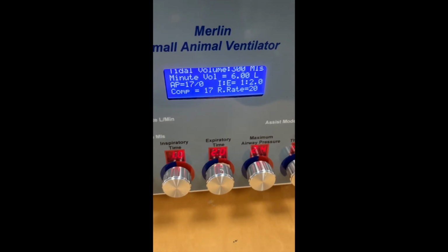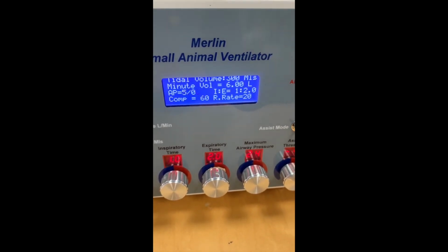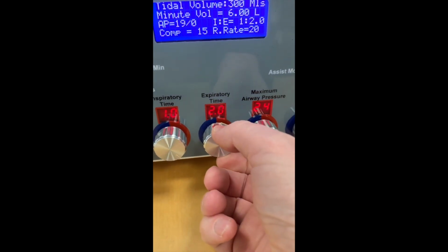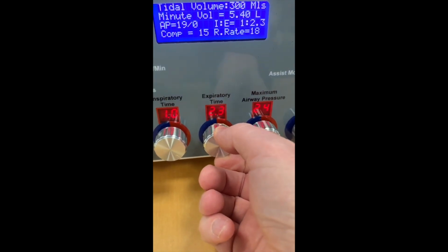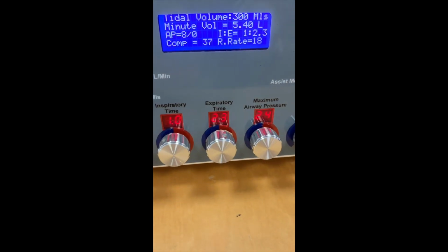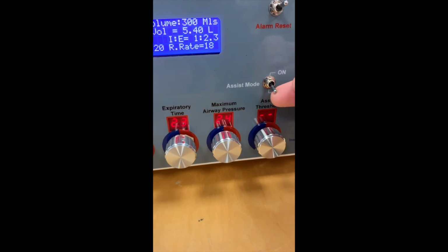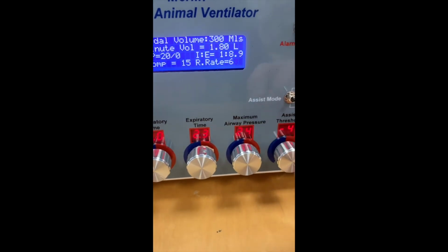So this was our volume mode setup that we had before, 300 mils tidal volume and a respiratory rate of 20. I'm just going to change the respiratory rate to 18 just to demonstrate the effect. So there we have a respiratory rate of 18, a minute volume of 5.4 litres, and I'm going to put the assist mode to on.